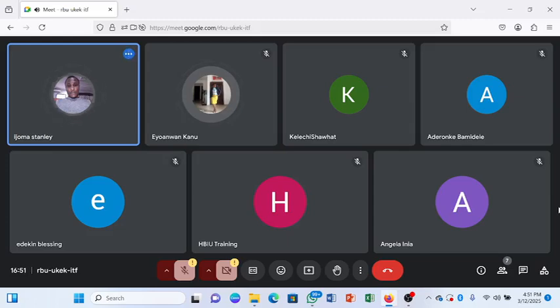After some time, you hear that this patient has bled to death or has gone into shock as a result of bleeding. So before any surgery is done, this blue cap is used to take a sample, which is taken to the lab to check the clotting time of this patient, to see that, okay, after this surgery, blood can clot in due time and the patient will be fine.